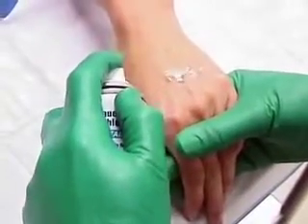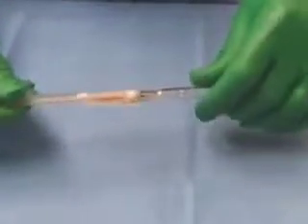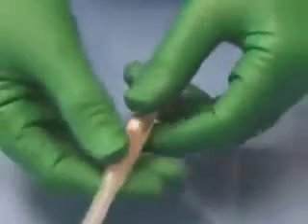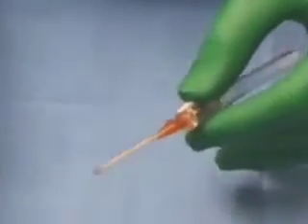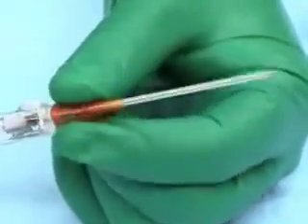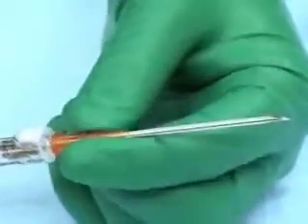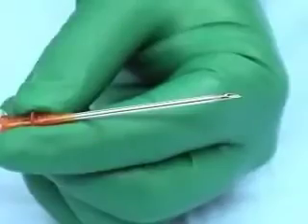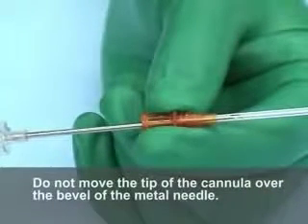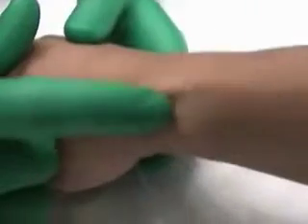To prepare the catheter, inspect the metal needle and plastic cannula for any damage or contaminants. Both should be smooth. Spin the hub of the plastic cannula to verify that it moves easily off the metal needle. Do not move the tip of the cannula over the bevel of the metal needle, as this could damage the end of the cannula.